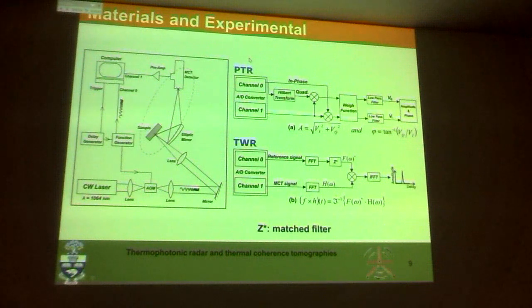So I can have two channels, in phase and quadrature, again through a Hilbert transform. This is memories of what I said 2.5 hours ago. I can get mixing of these two and a weighting function to get rid of some of the side lobes, even though here side lobes are much less important than in acoustics because they're already dampened. So you have very little interference from side lobes, but then finally you do this mixing and low pass filtering.